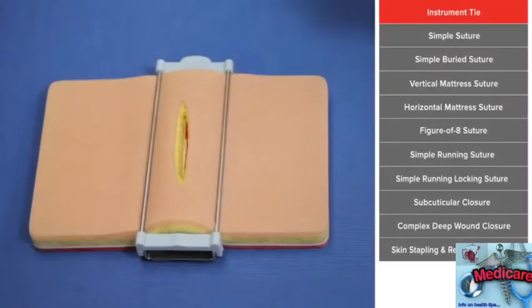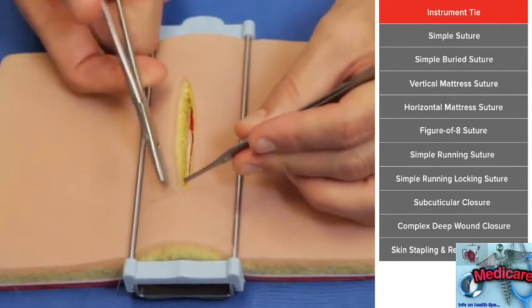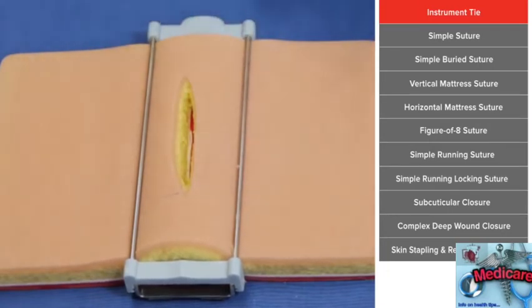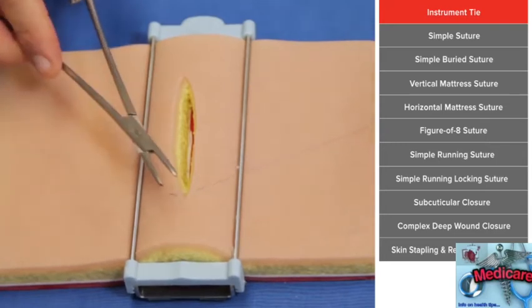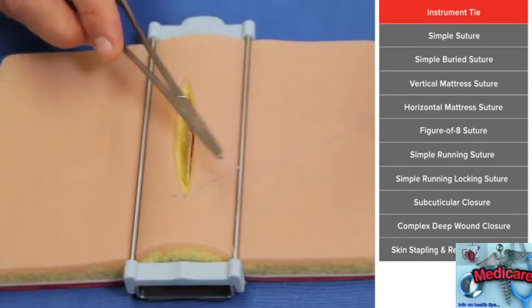All right, before we get started with teaching different types of suturing, I want to teach how to tie the knot. The simplest way to do this is with an instrument tie. You simply pass whatever suture we're doing into the skin, and when you're ready to tie it, what I'd like you to do is pull the suture all the way through, but leave a small short tail, about 1/4 of an inch, 1/2 inch is plenty. So you'll have a short end and a long end. And we're going to keep this pretty simple.